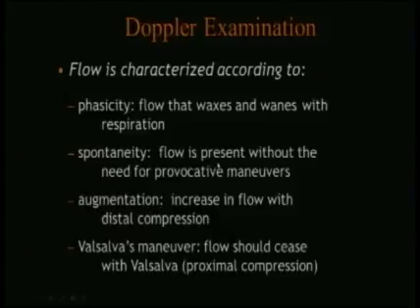Now, flow in the lower extremity is characterized primarily at the level of the common femoral vein according to its phasicity. Flow at the level of the common femoral vein should wax and wane with respiration.